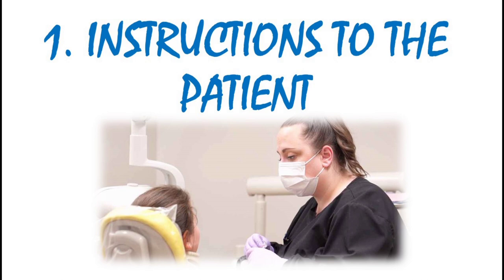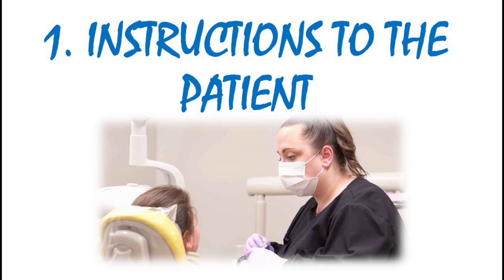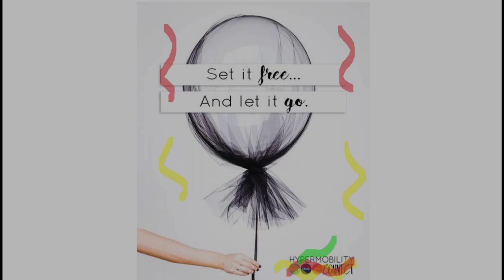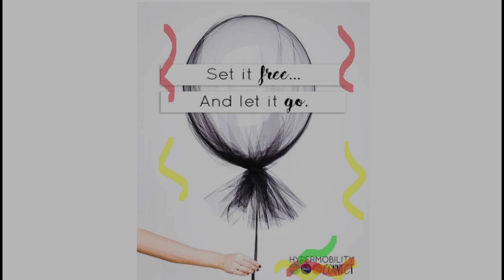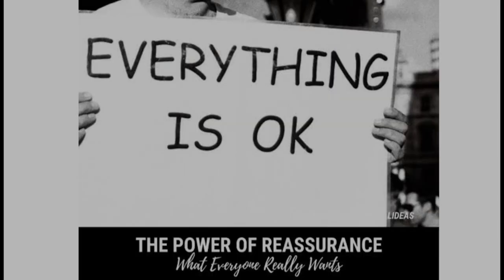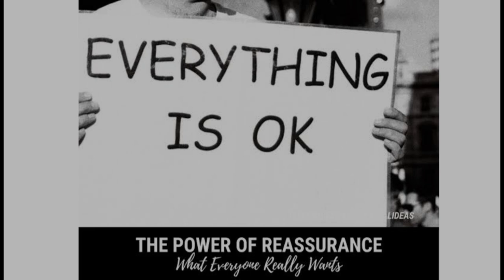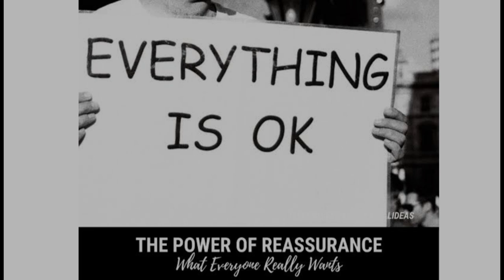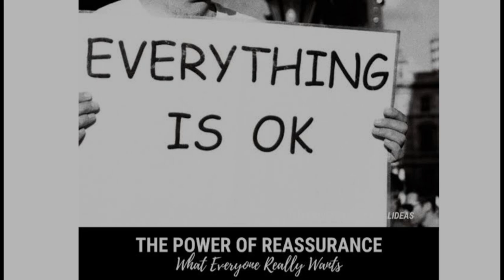The first thing before we make an intraoral periapical radiograph is to give instructions to the patient. The patient should leave his or her neck, head, tongue, lips and cheeks free for us to place the film easily. Reassure the patient that since the edges of the radiographic film are sharp there are chances that may cause pain, but not to worry as it is not going to harm the patient.